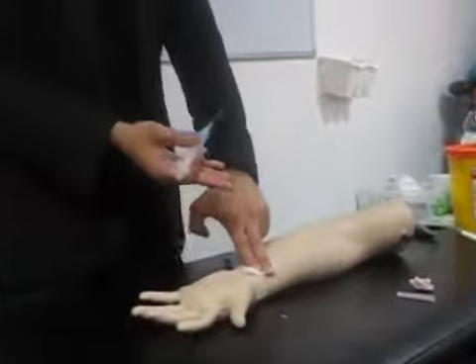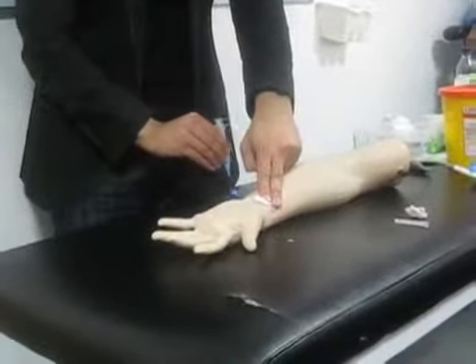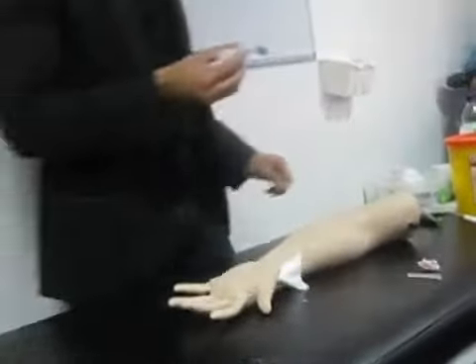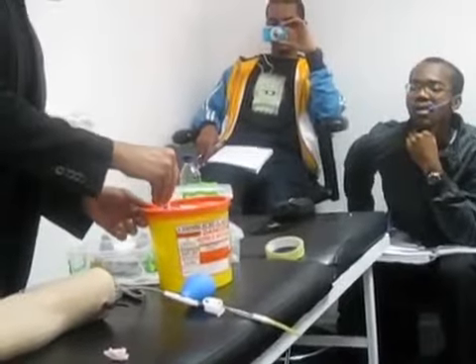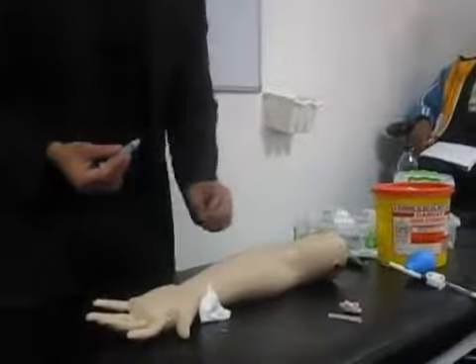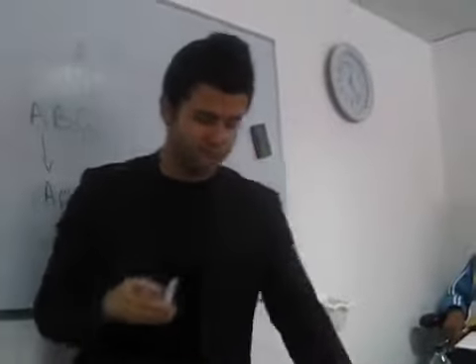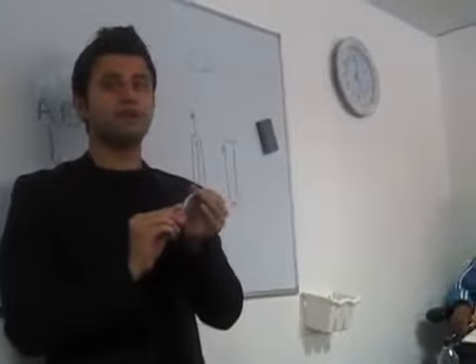I'll hold it and apply pressure myself for 3 to 4 minutes. I'll take it myself to the ABG machine.